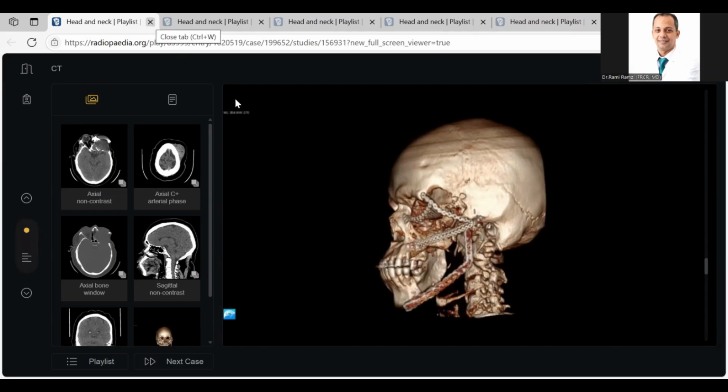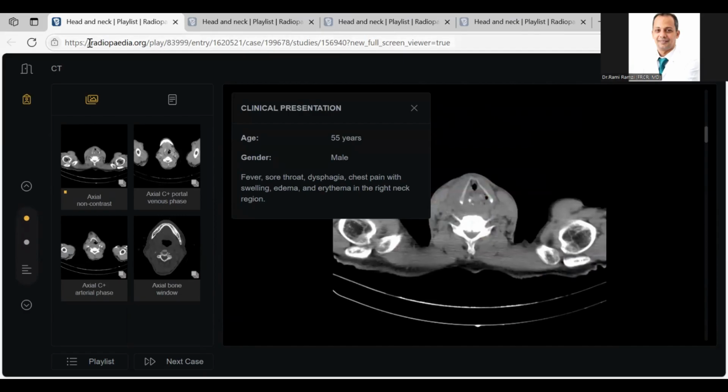It was very difficult. Sir, one more thing. What about the lesion in the scalp along the frontal bone, frontal scalp? I think it is separated from the original bed of the surgery. It is separated. I think it is another entity. It may be another pathology, something like metastasis. I will put the answer in our group. Yes, but the most important thing is to focus on the recurrence and the status post-operative. Next candidate, please. Thank you, sir.